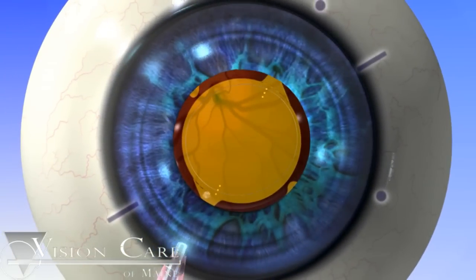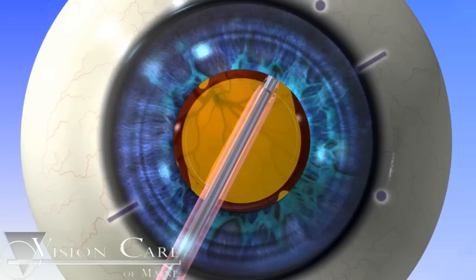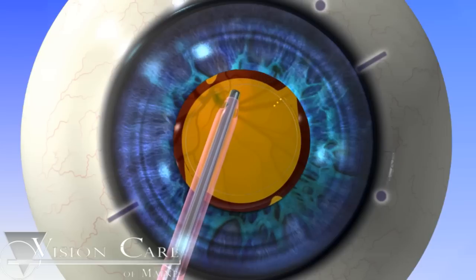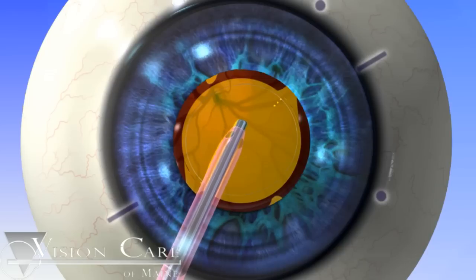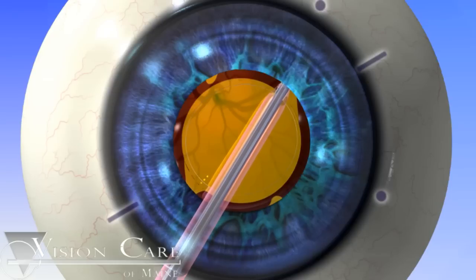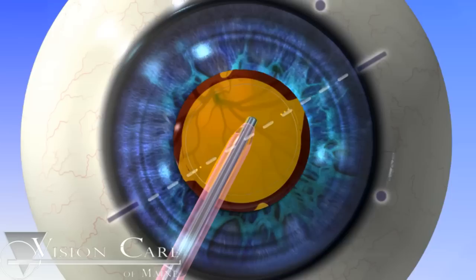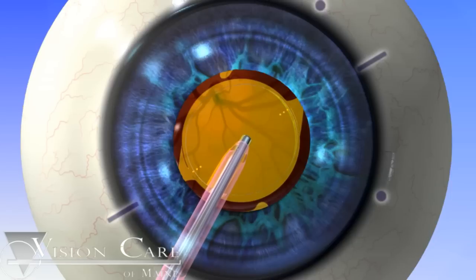After implantation, the surgeon begins the process of aligning the marks on the ACRISOF IQ Toric IOL with the steep axis marks on the cornea. When the lens is within 15 to 20 degrees of its final intended placement in the eye, the surgeon removes all residual viscoelastic and gently rotates the lens into its final position, ensuring that the marks on the lens are aligned with the steep axis marks on the cornea. The surgeon then gently compresses the lens to the back of the capsular bag to ensure that the lens will remain in the desired position following surgery.